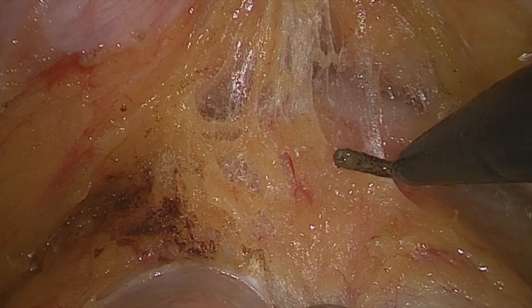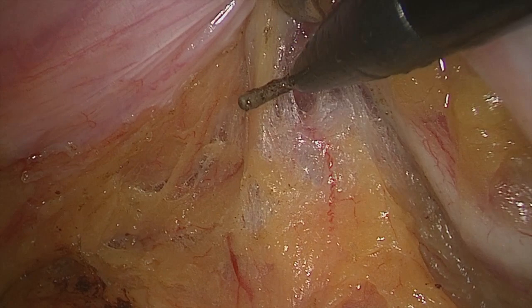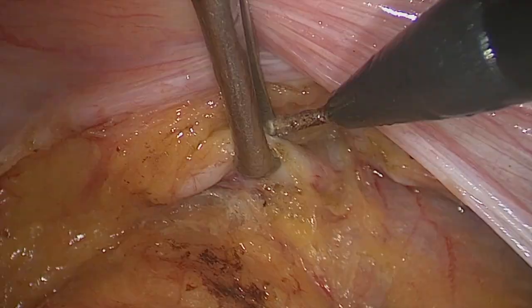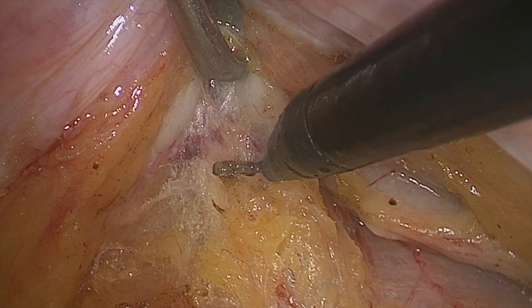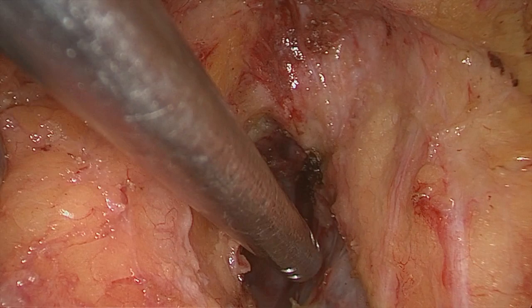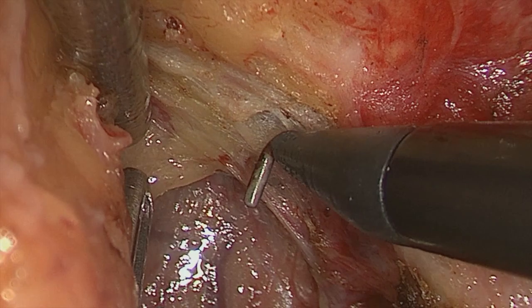In order to correctly expose Denonvilliers' fascia, the seminal vesicles have to be identified beforehand. The rectum is dragged to the opposite side, revealing the lateral ligament, which was later excised and dissected for the purpose of exposing the loose connective tissue overlaying the levator ani.